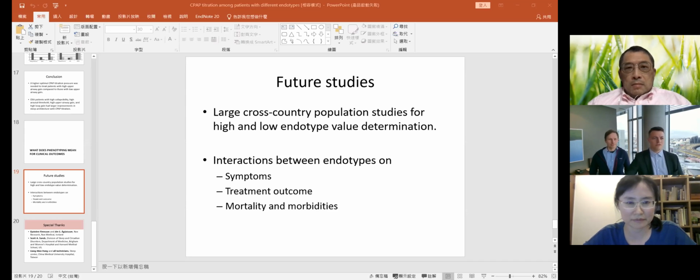I want to take one of the questions here, and please, everyone, feel free to write your questions in the Q&A field. There's one very interesting question regarding patients that have recurrent hypopneas and a low number of apneas on a home sleep apnea test. Do they potentially have a low arousal threshold, and is this an indication of that? Obviously you wouldn't see the arousals, lacking the EEG. But is this a clue, that people undergoing HSAT with recurrent hypopneas and few apneas have a low arousal threshold? What's your opinion on that?